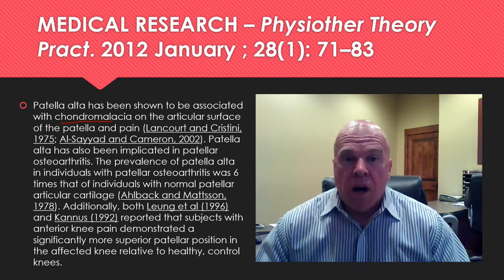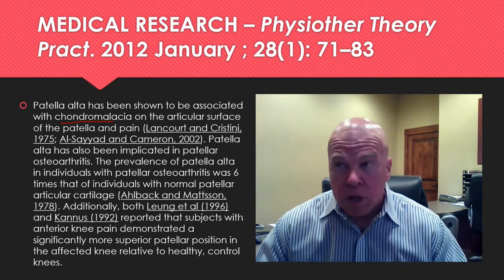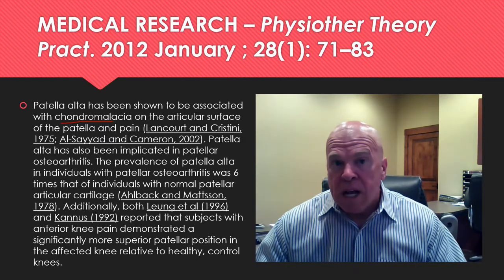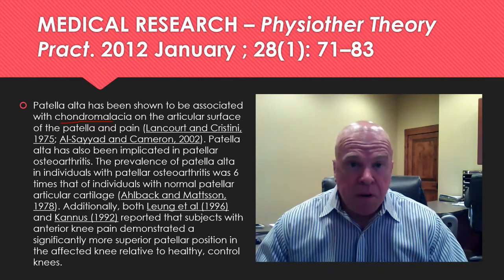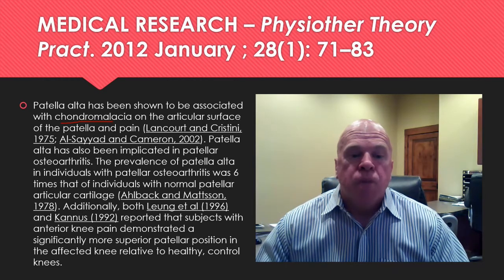Patella alta has also been implicated in patellar osteoarthritis, and we do have MRI and X-ray findings for patellofemoral arthritis in the form of inferior, lateral, and superior osteophytes on the patella.